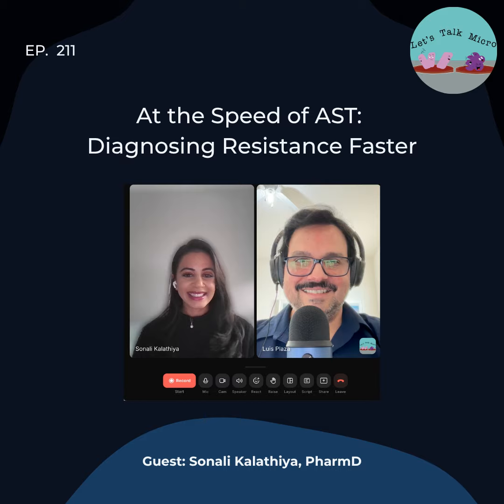The same thing if you go to conferences and you see someone presenting on this or see vendors, talk to them. And as you said, create those contacts. It's very important. And definitely, yes, communication. And I like the fact that you brought up the polymicrobial. That's something to keep in mind because we've been talking about how this works. But yeah, in that case, as of right now, if you get different morphologies in your gram stain, then you have to proceed with your traditional method where you plate it and then after that isolate your colonies and then perform appropriate susceptibility testing.